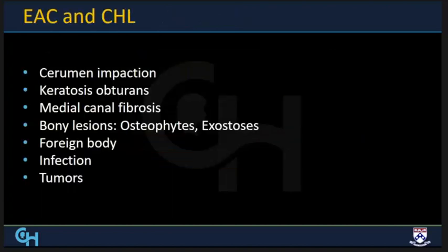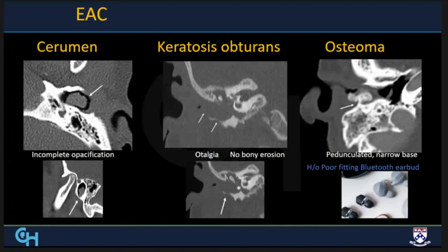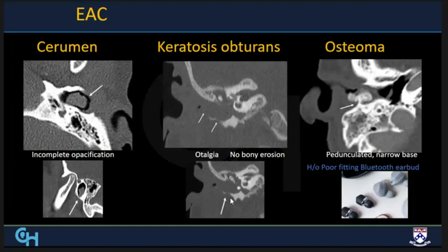Starting with the external auditory canal: cerumen accumulation is mostly incidental, causing incomplete opacification with the bony canal intact without erosion. In keratosis obturans, there is near obliteration of the external auditory canal with expansion and thinning but no erosion; clinically they present with otalgia. When there was concern about whether findings represented thinning or erosion, the patient underwent MRI and did not have a cholesteatoma — this was actually keratosis obturans.